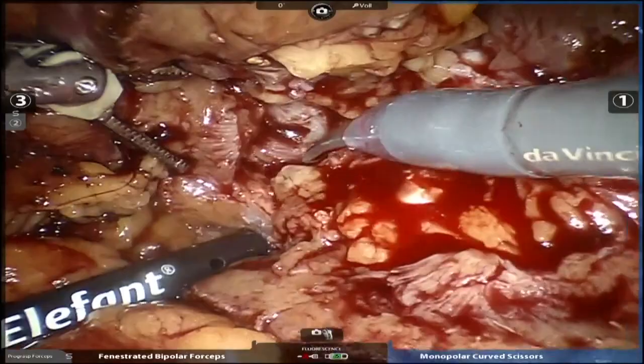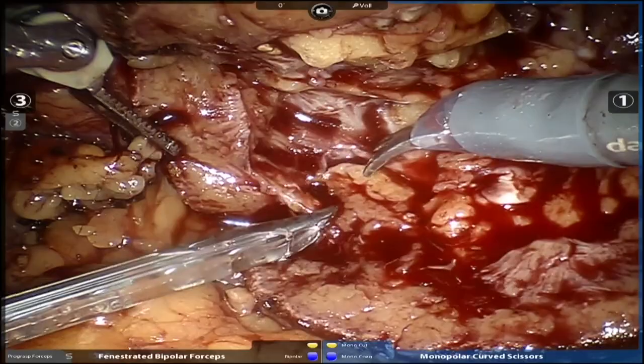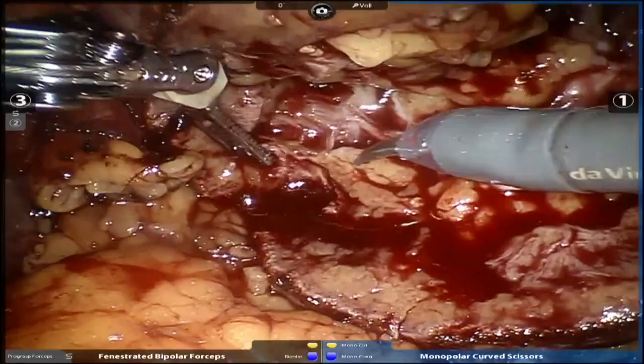Clip right here, Brando. Clip. Big vessel. Big vessel. Five. Yep. Right there. Perfect. You should have good access to it. Good. Stay in there. Stay in there, Brando. Yeah, stay in there.